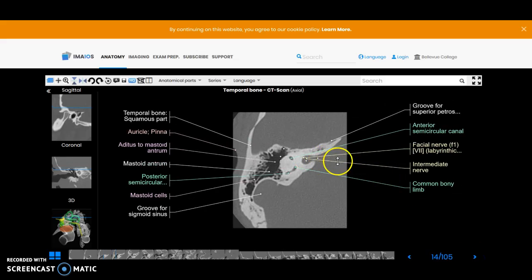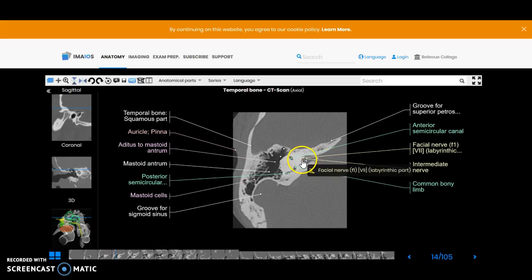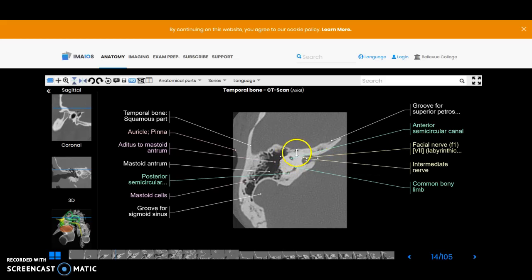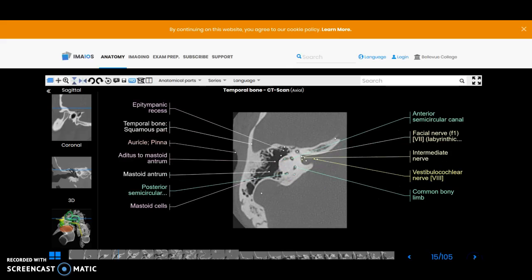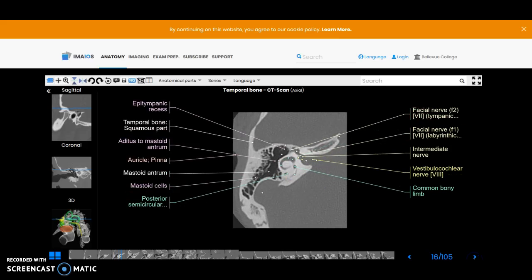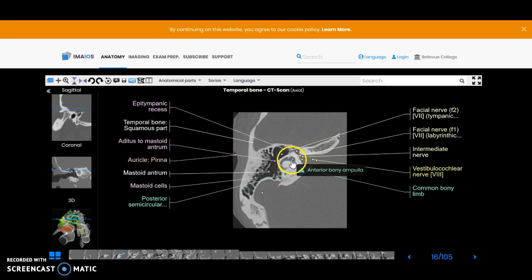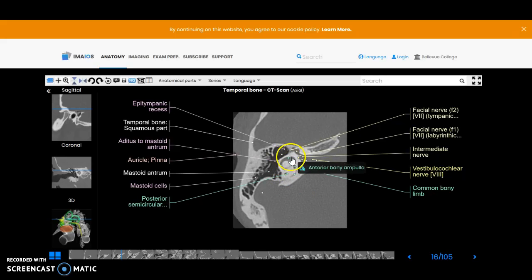Now we're just going to start to come in where you can see the seventh and eighth nerves coming in here as they course toward the cochlea, and then you can see the semicircular canal here as well and the ampulla.